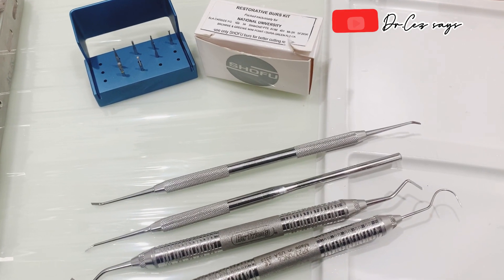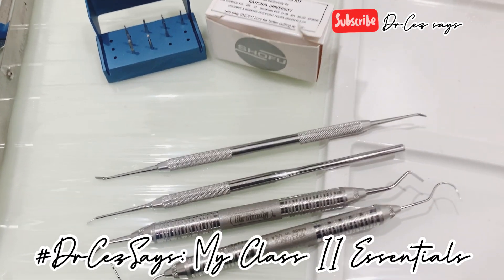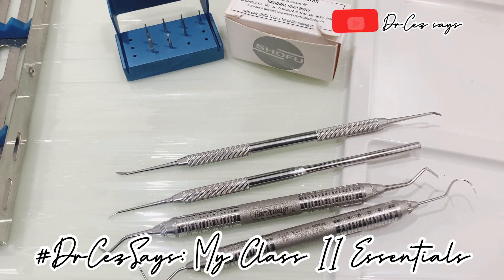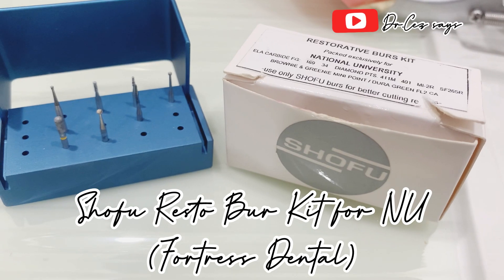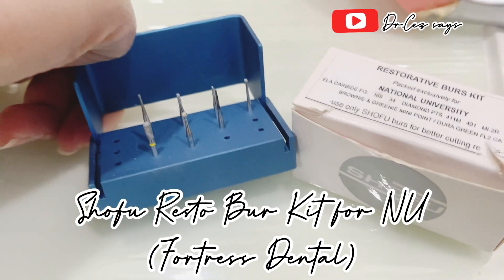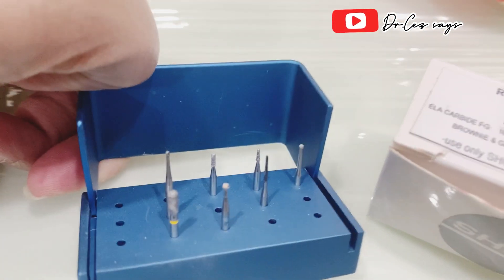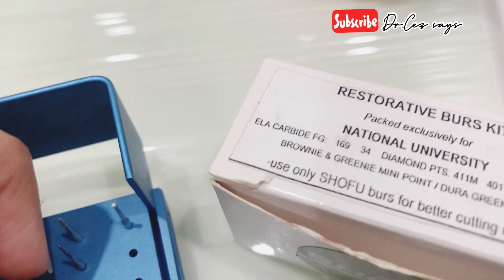For the instruments that I use for my Class 2 amalgam preparation, I only have this very minimalist setup. For the burs, I use the Shofu New Resto Bur Kit that I personally and carefully selected. I only use three burs for my preparations.